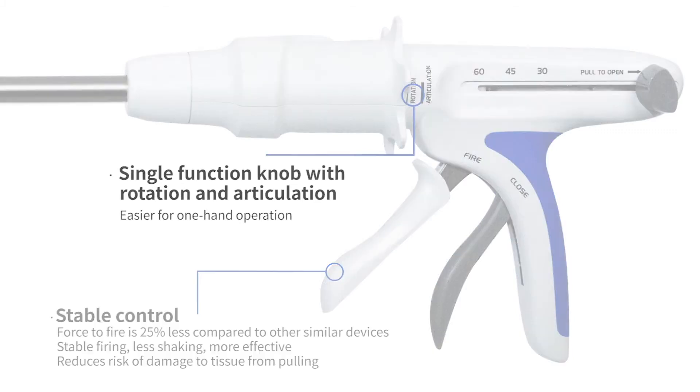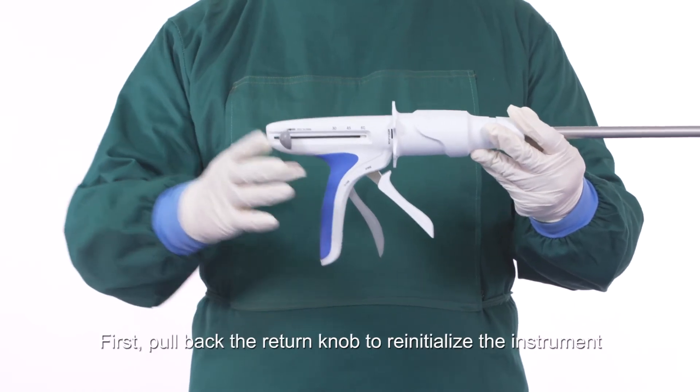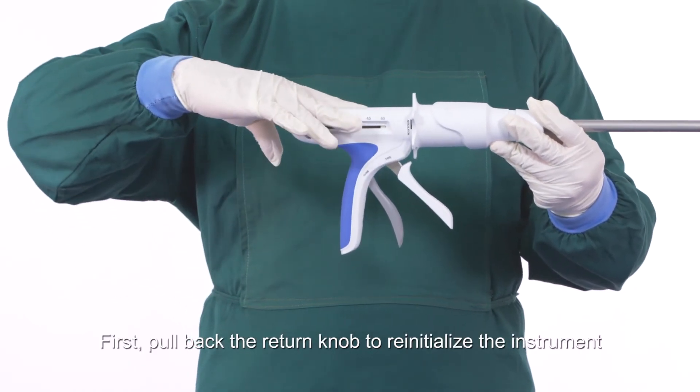Single function knob with rotation and articulation makes it easier for one-handed operation. Instructions for use and precautions — cartridge installation: first, pull back the return knob to reinitialize the instrument.